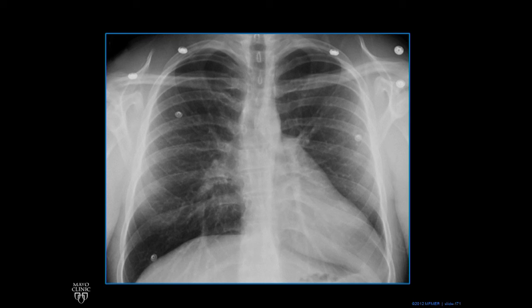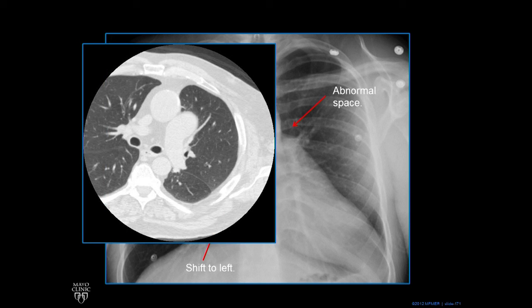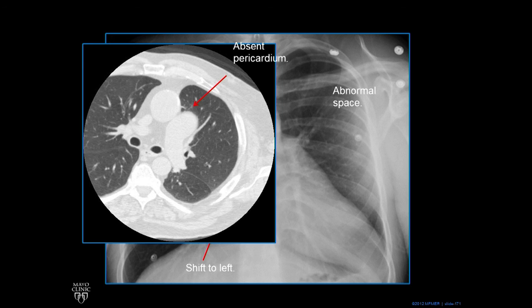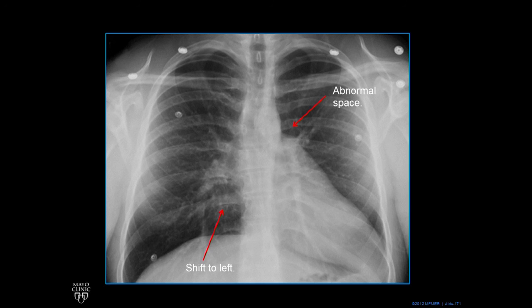Here's another one — this is not normal. There's a space, a gap there — that's odd. Normally this border is made by the right atrium, but here it's being made by the spine. The whole cardiac silhouette is shifted to the patient's left. If we look at this cross-section of a CT scan, we see the aorta and the pulmonary artery, and there's a little wedge of lung between them that's not normally there. Normally there's a membrane called the pericardium which holds the heart and great vessels, and lung doesn't poke in there. This patient has congenitally absent pericardium, which causes this abnormal space and the shift to the left. It's not really a pulmonary artery problem, but it's an example of an abnormality in the region where the left pulmonary artery should normally be — it's actually displaced a little bit because the pericardium isn't holding things together normally.